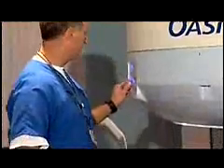This is something that hasn't always been easy to achieve. The MRI images take several minutes to produce, so it's very important for the patient to remain completely motionless during the entire examination. And a comfortable patient is more likely to remain motionless and to provide high-quality, sharp diagnostic images. Any motion tends to degrade the images, sometimes to the point beyond our ability to make a good diagnosis. But breakthroughs in MRI technology have helped the procedure become easier for both patients and medical staff.